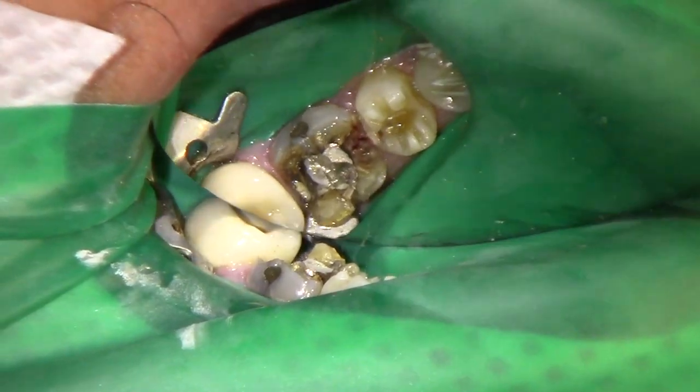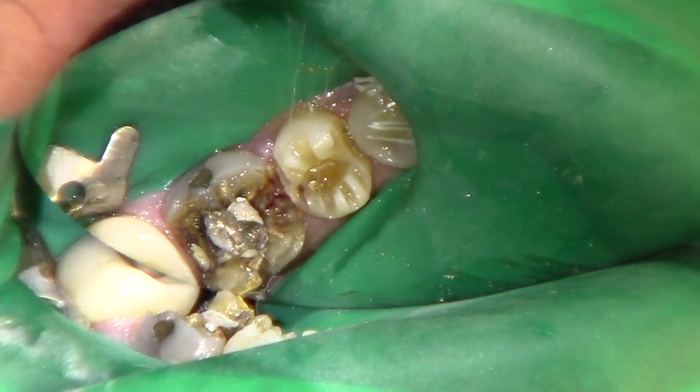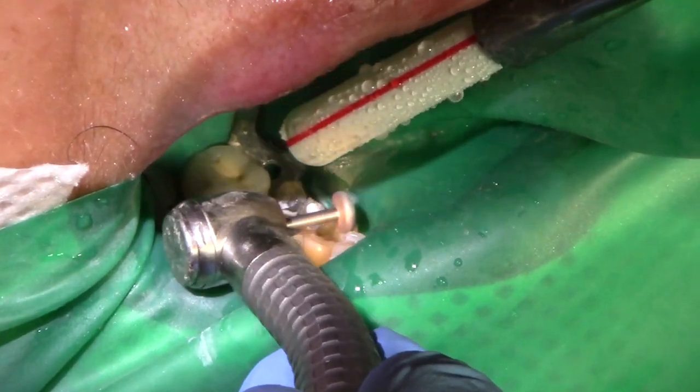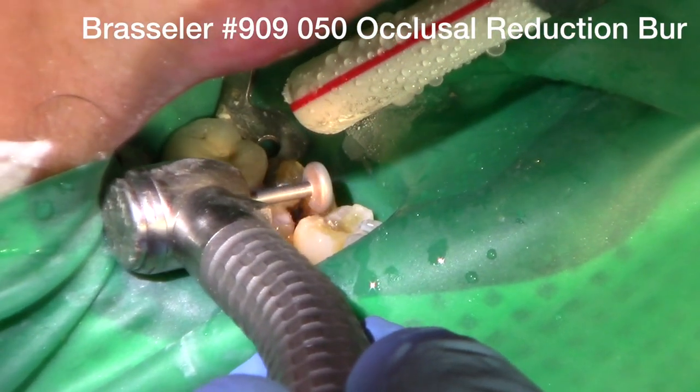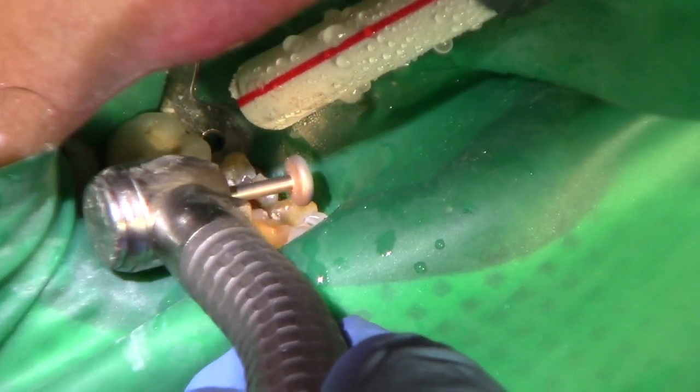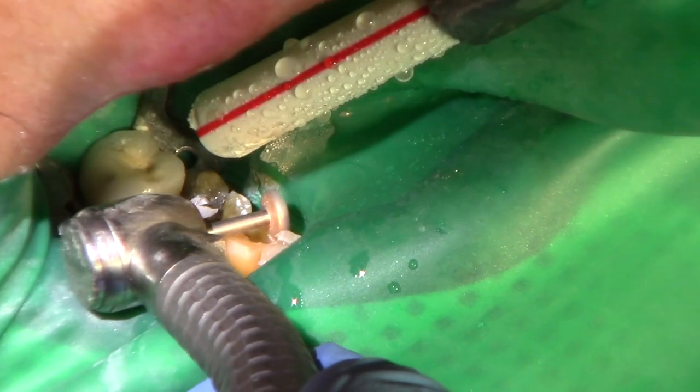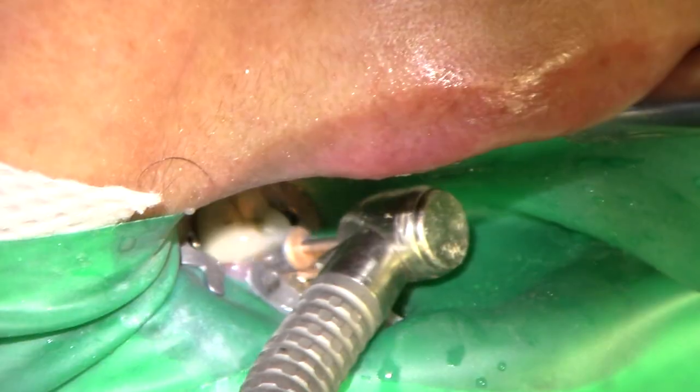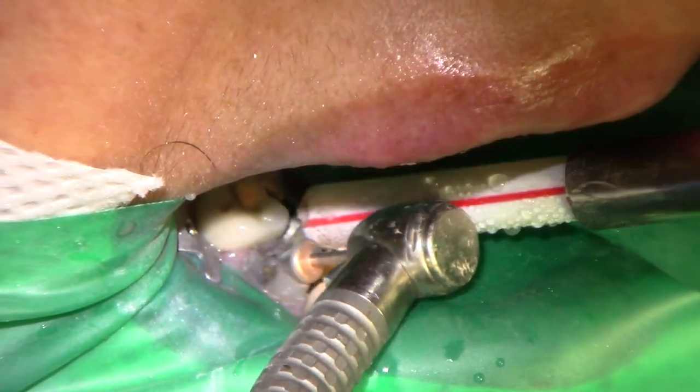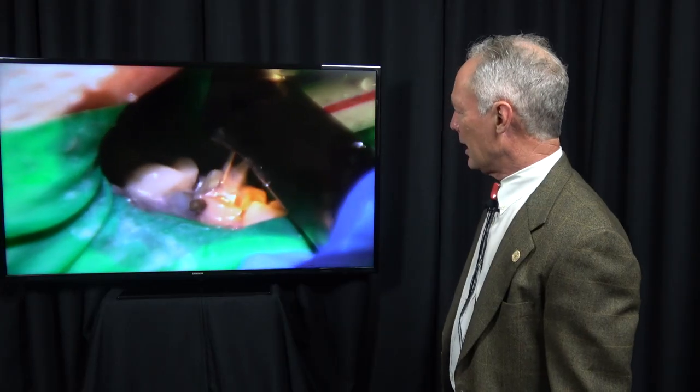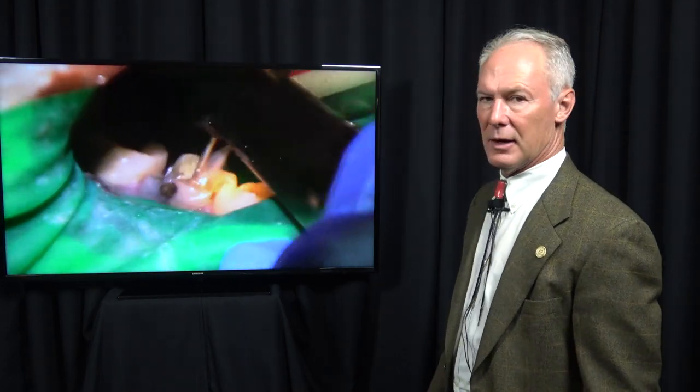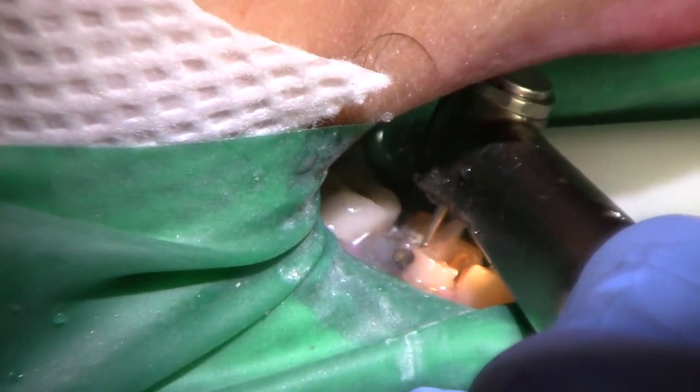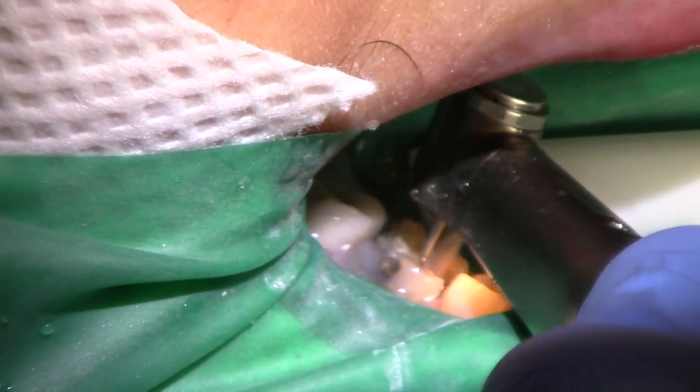Most of the cut was into the gold crown. You can see all the decay on that molar tooth. Now I'm just completing my occlusal reduction with the occlusal reduction burr, and I want about a millimeter and a half of occlusal clearance. Since there was decay under the crown, I want to remove all the old amalgam filling.